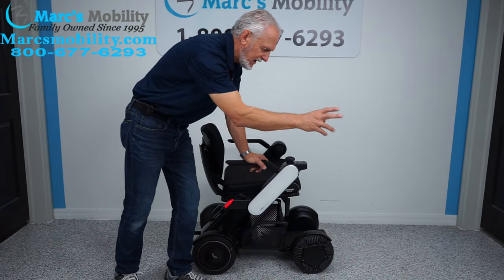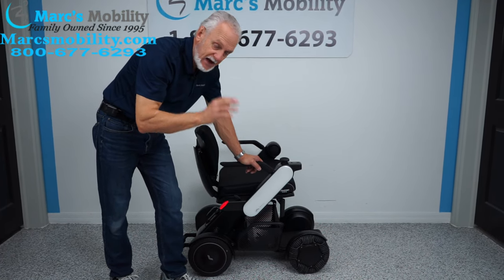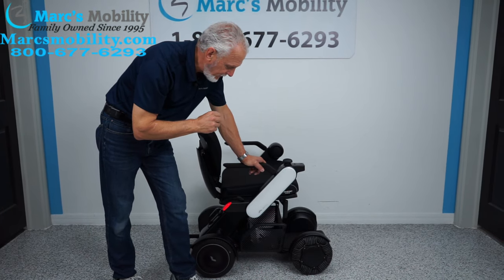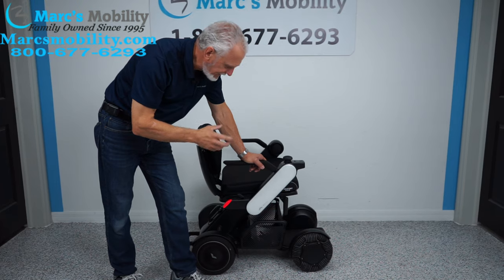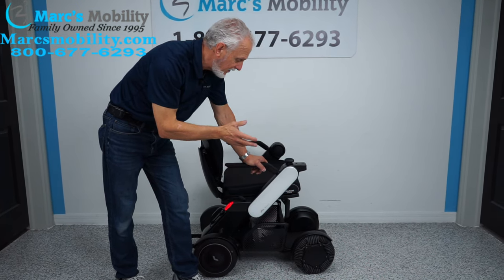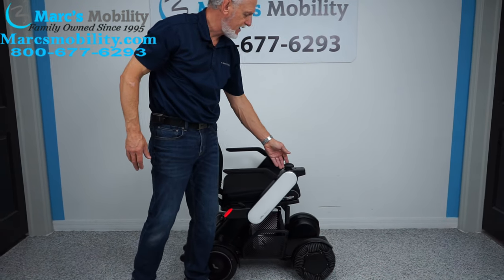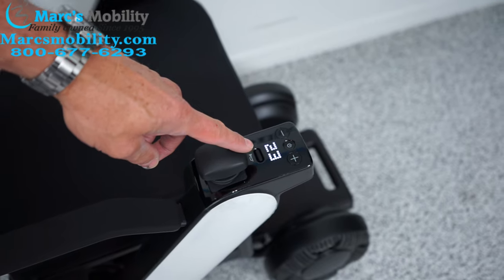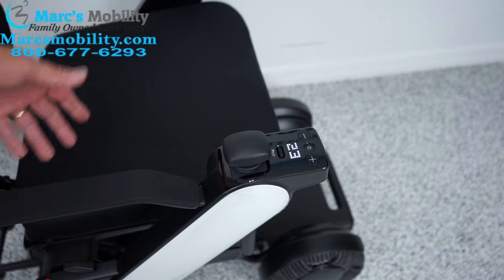This power chair has a range of up to 11 miles. Some will get more, some less — it depends on how you drive, the weight of the user, and whether you're going uphill. The battery is a lithium ion that only takes about five hours to charge, much quicker than most batteries. This power chair is also approved for airline transportation — you can tell them it's a Will Power Chair and they'll be familiar with it. The joystick displays how much power you have left — mine shows 23, on a scale from 99 to zero.